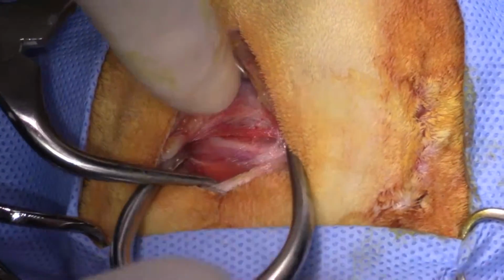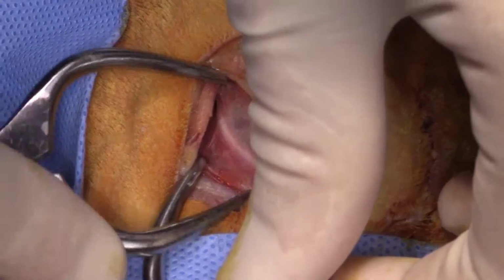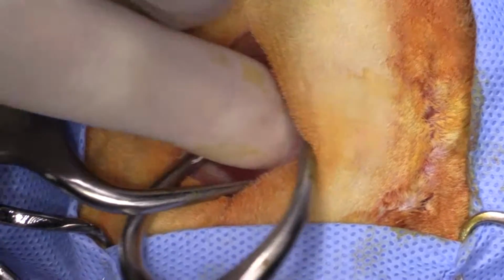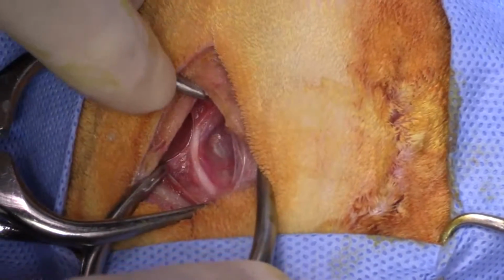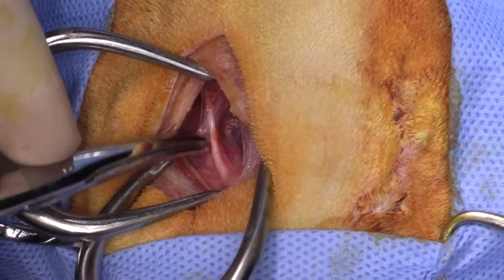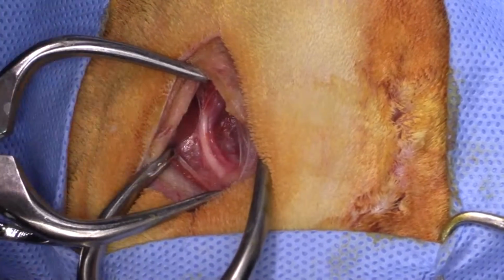It's our hypoglossal nerve sitting right there. Try not to retract that too much. So that's down onto the bulla right there. I assume you guys can see that big white structure right there. So that's the hypoglossal nerve. And I'm scraping onto the bulla right there.